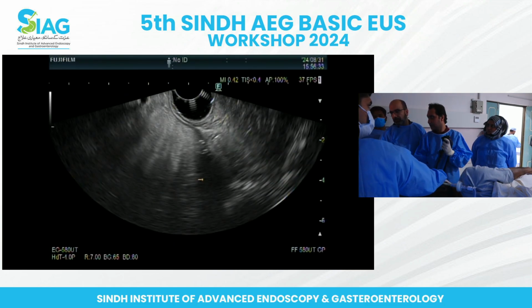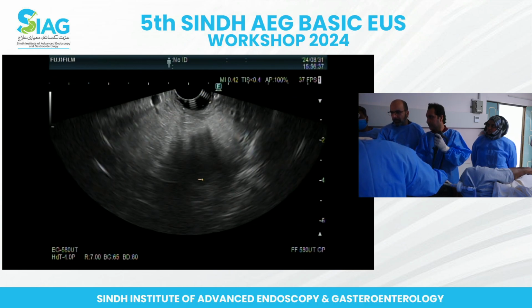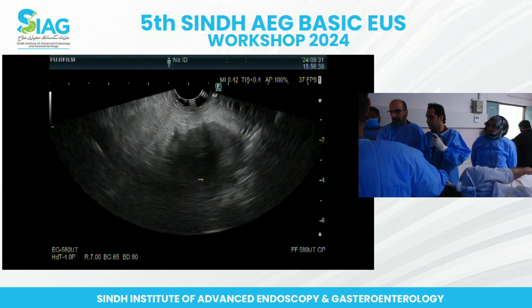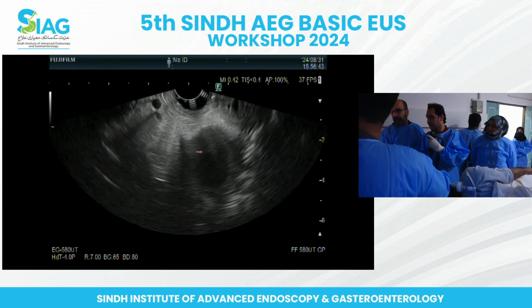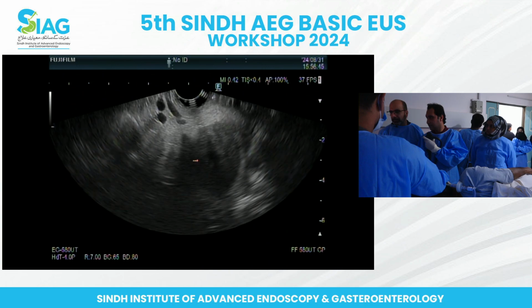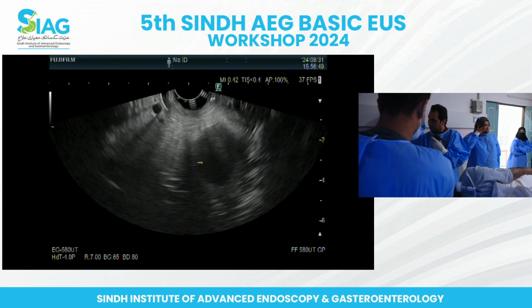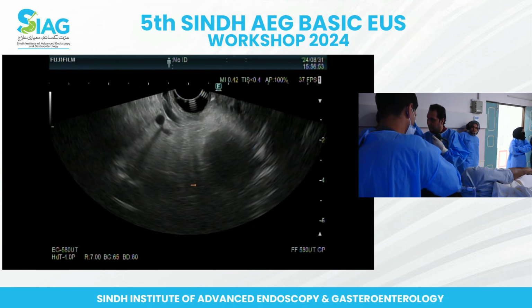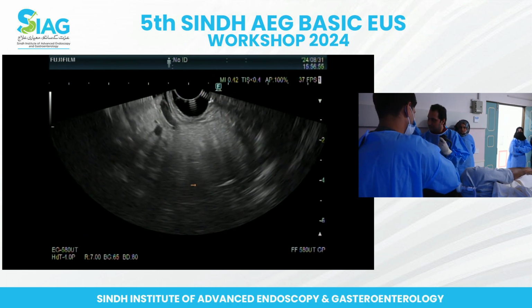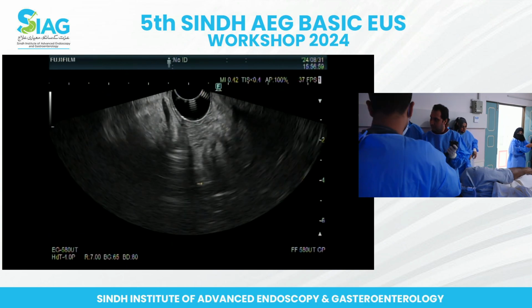That's going to be air in the duodenum. So keep going clockwise. Push scope forward more, and big wheel towards you, and go counter now because you lost it. This, by the way, looks like a lesion, right? Yeah. So we're starting to see something that is concerning. But now go counter for a second. But that could be the stent in there. Go counterclockwise. Keep going counter. It's okay, keep going counter. Keep going counter.